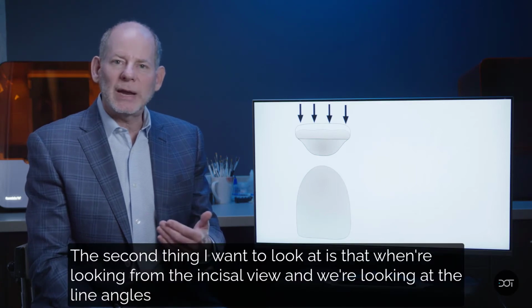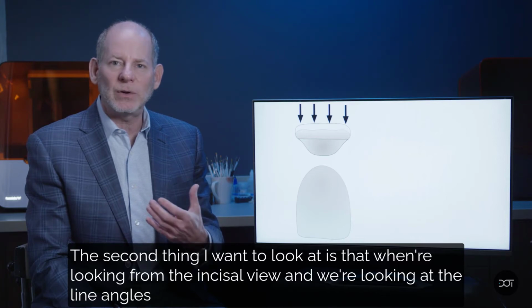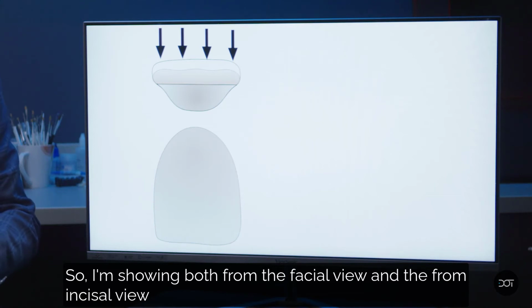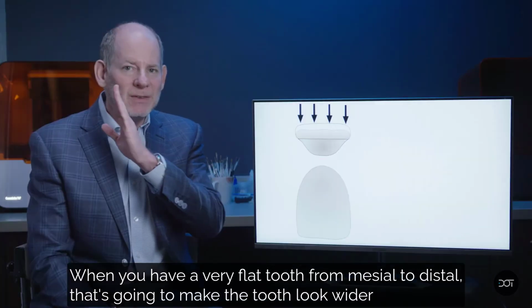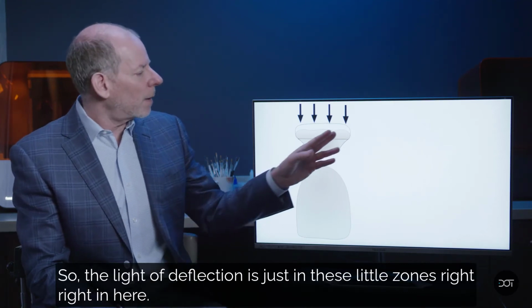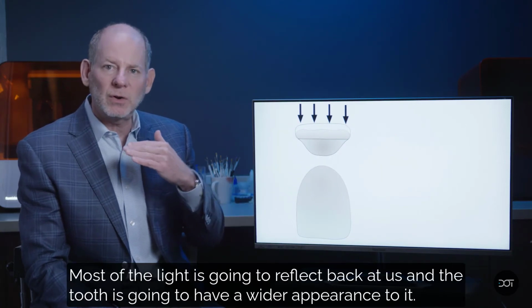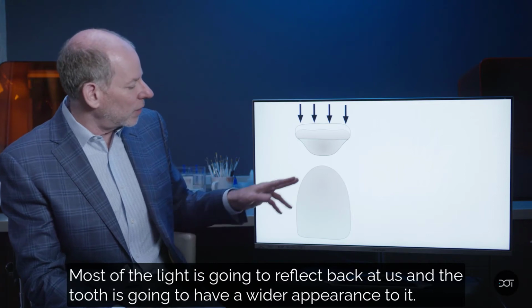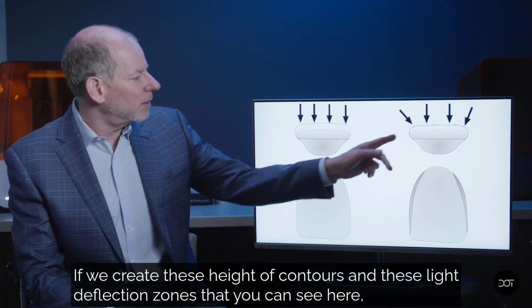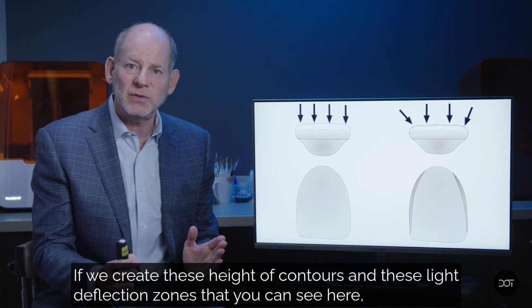The second thing I want to look at is when we're looking from the incisal view at the line angles. So I'm showing both the facial view and the incisal view. When you have a very flat tooth from mesial to distal, that's going to make the tooth look wider. The light deflection is just in these little zones right in here. Most of the light is going to reflect back at us, and the tooth is going to have a wider appearance to it.